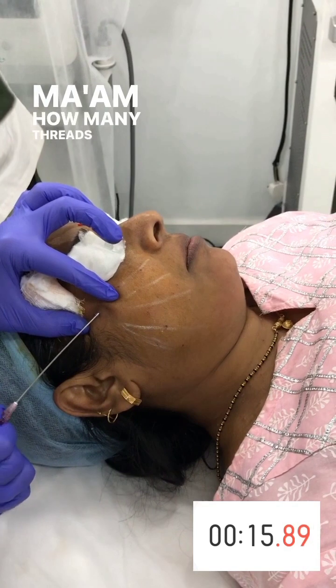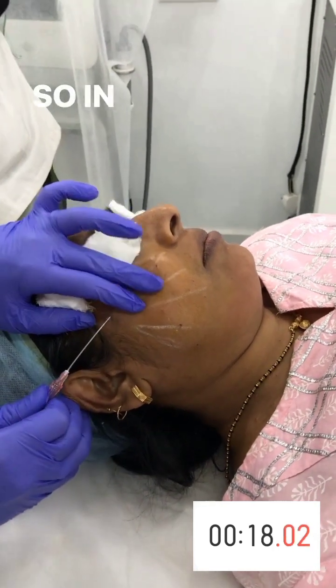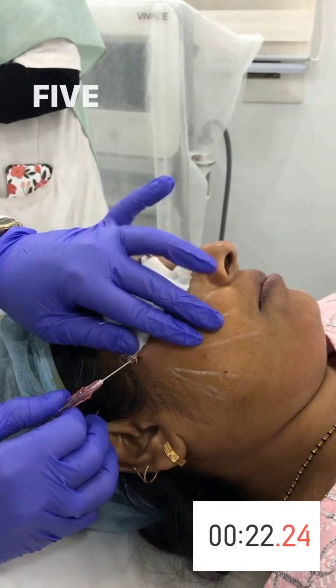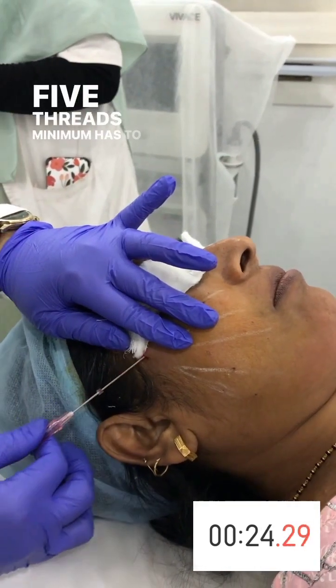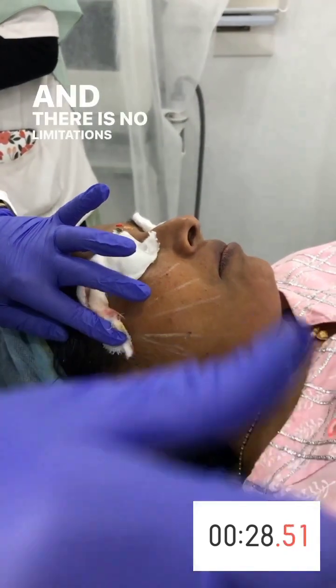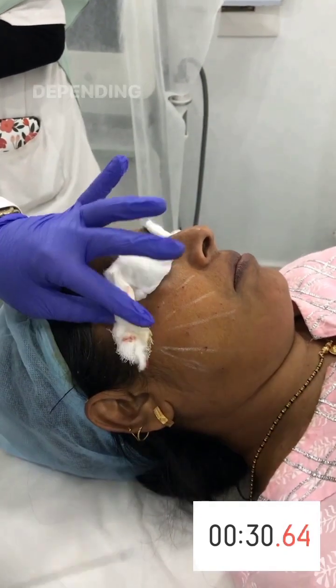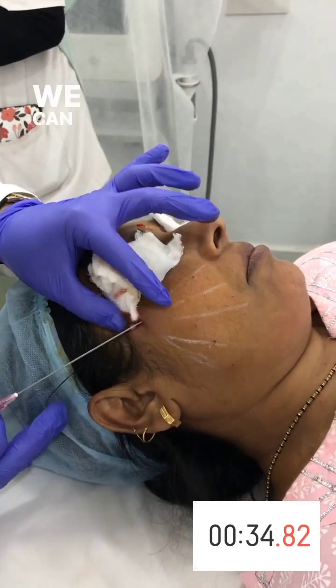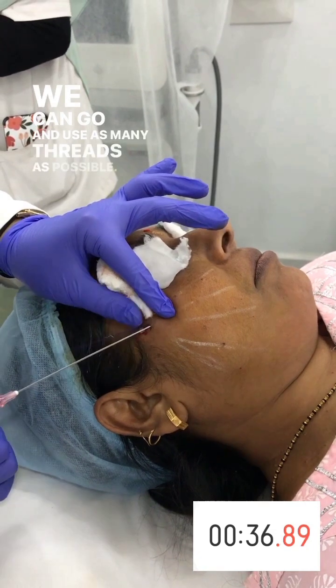Ma'am, how many threads will you use? If you want a basic facelift, 5 threads minimum has to be used to get good results. And there is no limitation to the number of threads that can be used. Depending upon the vectors, depending upon how much lift you are expecting, we can use as many threads as possible.